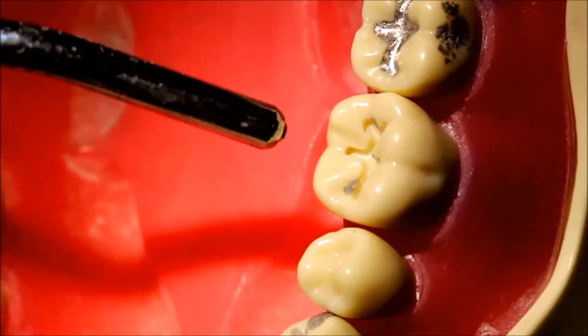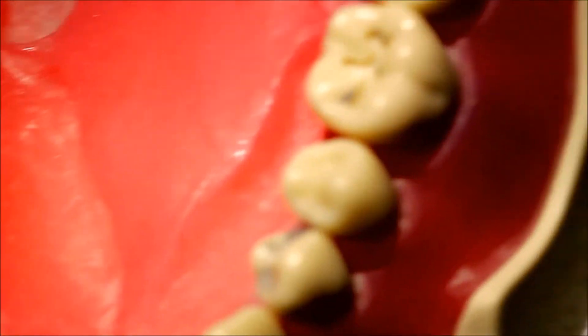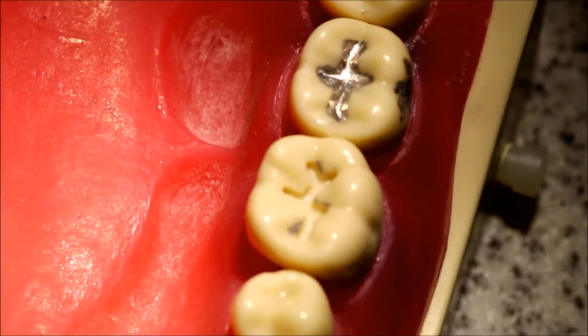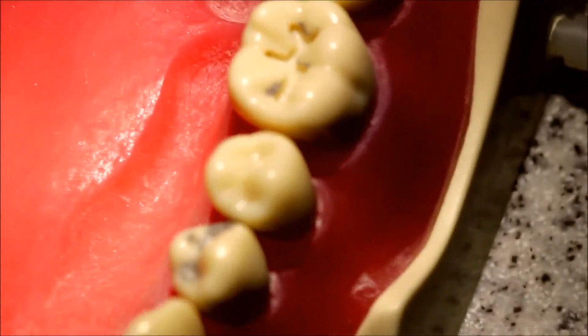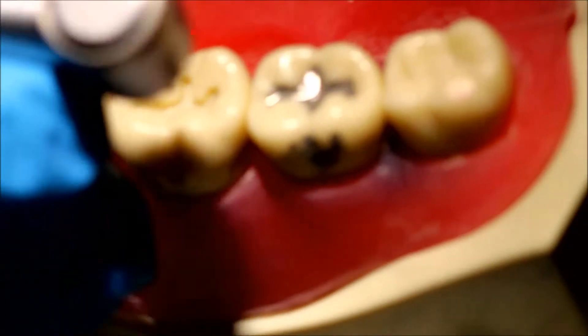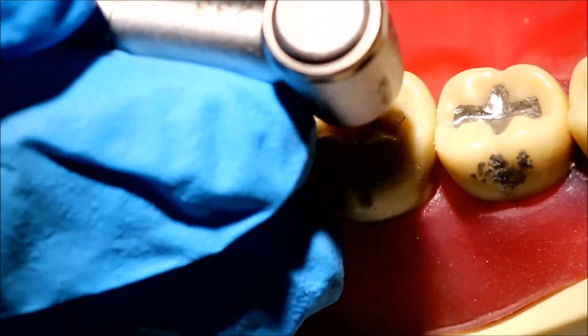The final step would be to achieve the 1.5 millimeter pulpal depth while trying to keep the pulpal floor flat. In all of these cuts, because I was using burrs like the 329 and 245 which have sharp surfaces on the bottom, they can leave gouges in your pulpal floor. To flatten it out, we're going to need a flat burr.